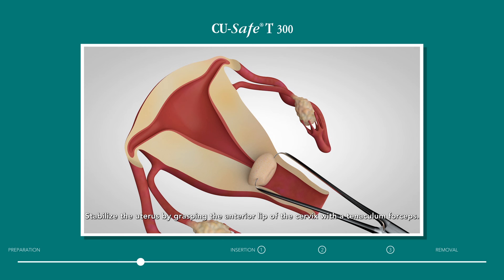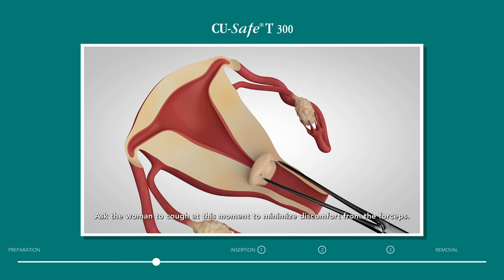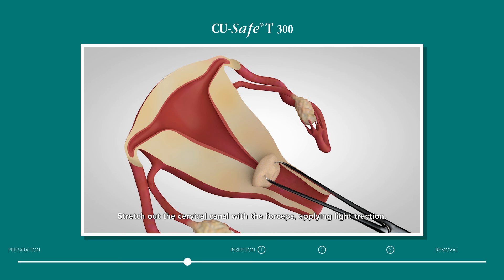Stabilize the uterus by grasping the anterior lip of the cervix with a tenaculum forceps. Ask the woman to cough at this moment to minimize discomfort from the forceps. If the uterus is in a retroflexed position, it is advisable to grasp the posterior lip of the cervix.